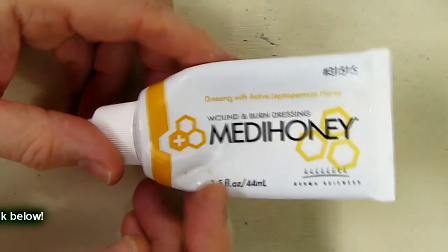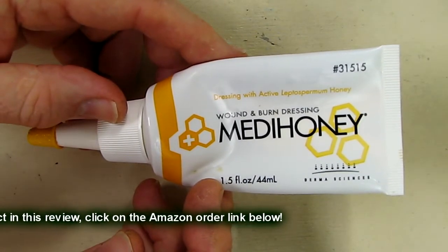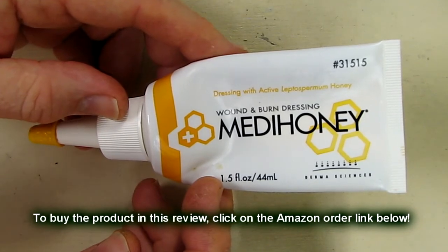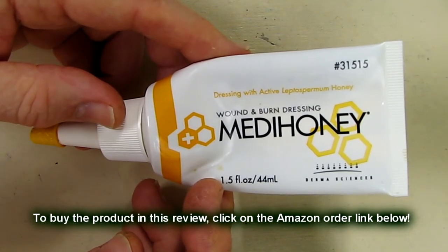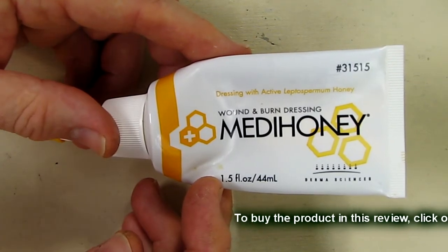This is a great product. I've used this for diabetic wounds or any kind of skin wound that doesn't heal, or even just a cut. This will accelerate the healing and it really does work. I can vouch for it.